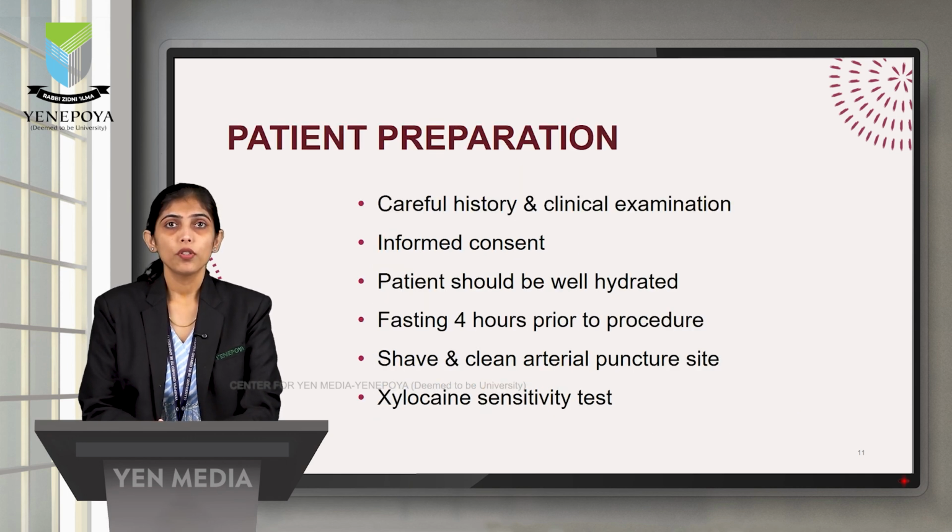So patient preparation. When the patient comes for the procedure, initially we take the patient history and the clinical examination is done. Then we explain the procedure to the patient. After explaining the procedure, we take informed consent from the patient. Then the patient should be well hydrated, fasting for 4 hours prior to the procedure, and we need to shave and clean the arterial puncture site, and xylocaine sensitivity testing is done.